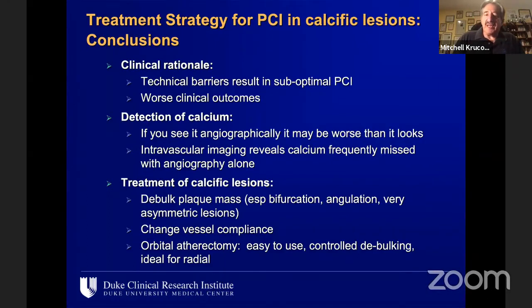And in treatment, I think the two key aspects to treating calcific lesions are to debulk the plaque mass and to change the vessel compliance, to allow delivery of devices that are appropriate in size and length, and to be able to deploy them homogeneously so they can do their job the way they're designed to in creating a vessel lumen, in eluting drug locally to prevent restenosis.